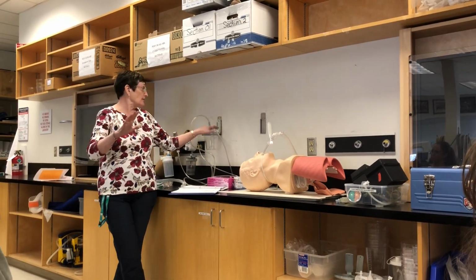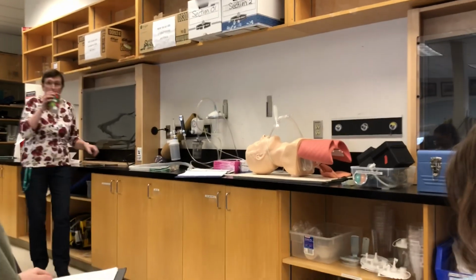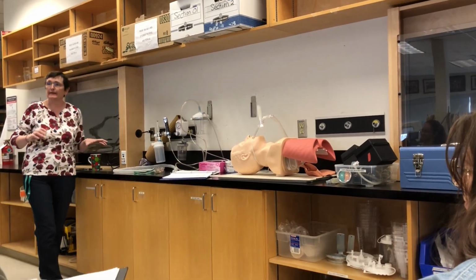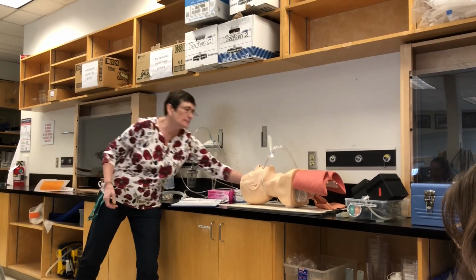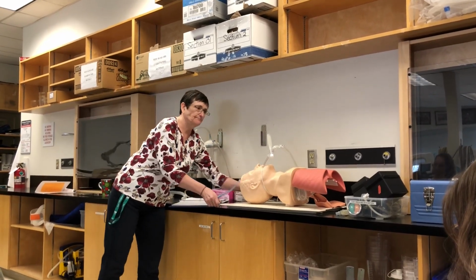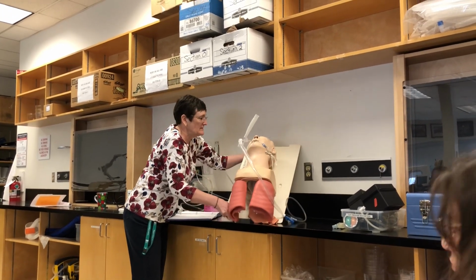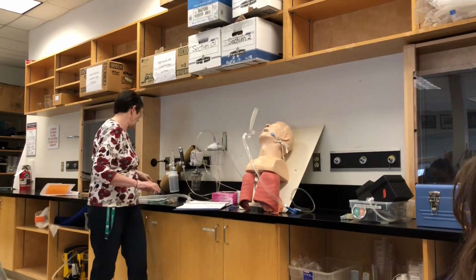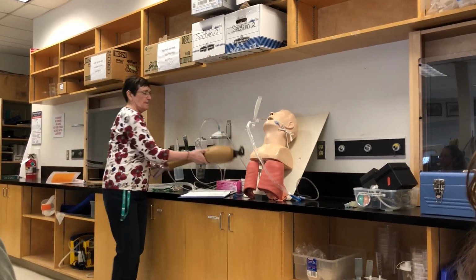All right, so I prepare everything that I'm going to need. What am I going to need for extubation? Suction and then have oxygen on standby. Yeah, you betcha. So I'm going to need suction. So I've got suction catheter, but I'm going to have my Yankauer ready to go. Yep. What else? Resuscitator. Yep. I'm going to have my resuscitator bag with flex tube on it, but I'm also going to have a mask. Okay, so I've got my bagger attached to oxygen.